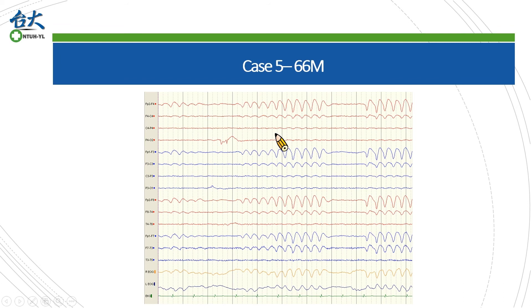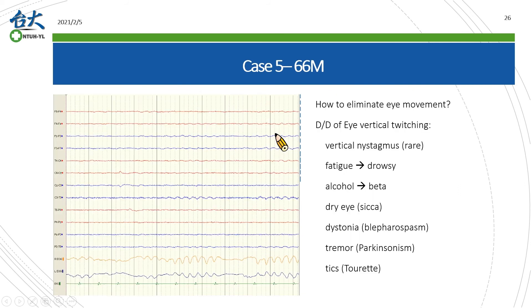Case 5 is another common artifact. It is characterized by bilateral synchronized rhythmic waves with maximum amplitude in the forehead region. An experienced EEG reader could identify them as eye blinking artifacts. The next question is how to eliminate the eye blinking artifact. Because in most cases eye movements are conjugated, we can easily remove such artifacts by changing to a coronal montage if you observe excessive vertical eye blinking or twitching in EEG.